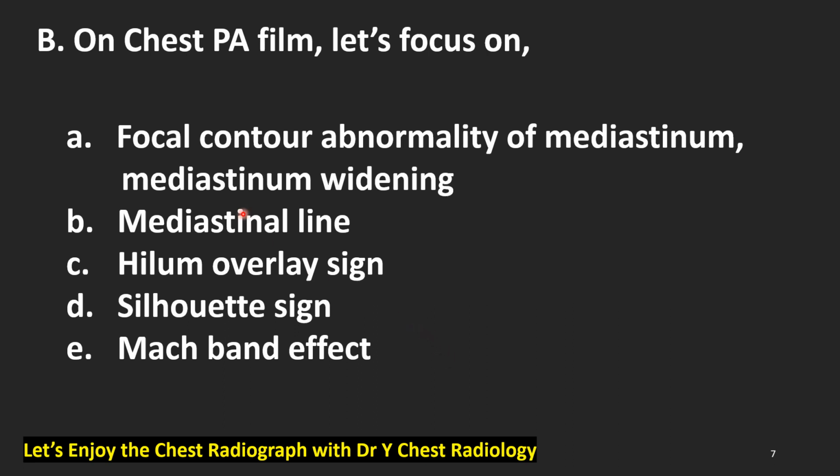For visceral compartment mediastinal lesions on chest radiograph, we should focus on A. Focal contour abnormality of the mediastinum and widening of the mediastinum. B. Mediastinal lines. C. Hilum overlay sign. D. Silhouette sign. E. Mach band effect.